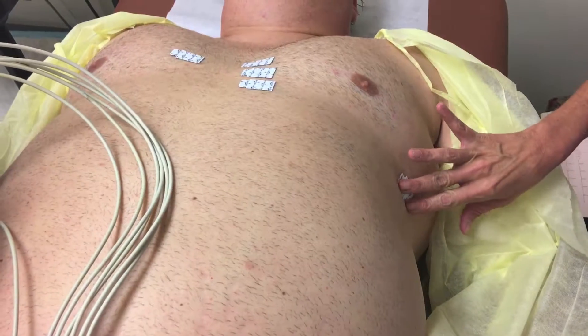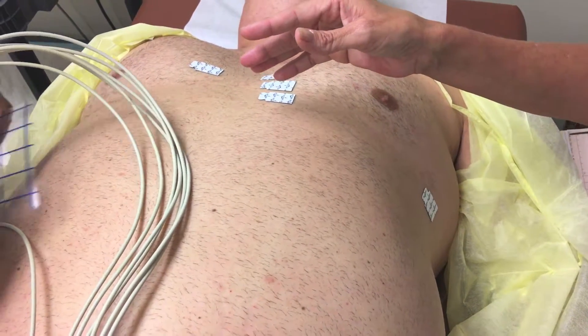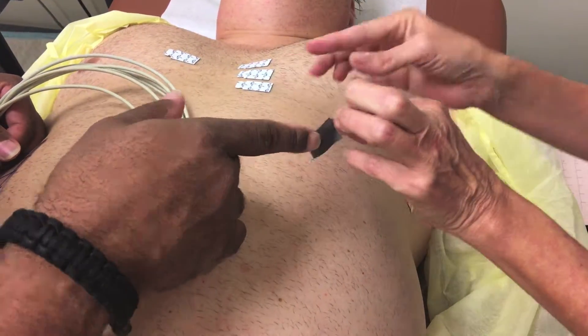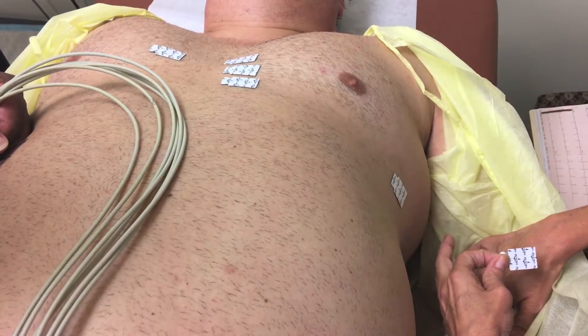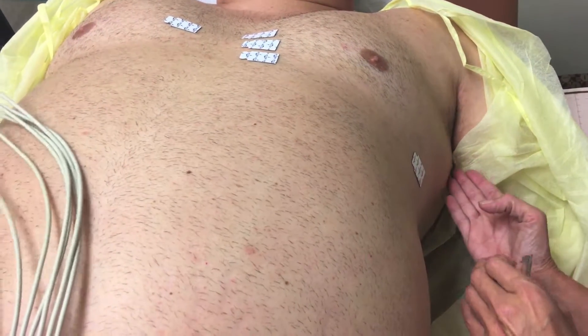And last but not least, V6 goes at the mid-axillary line at the same horizontal level as V4 and V5 — so that's basically cutting the armpit in half. Ms. Matthews, I need you to move your arm just a little bit.